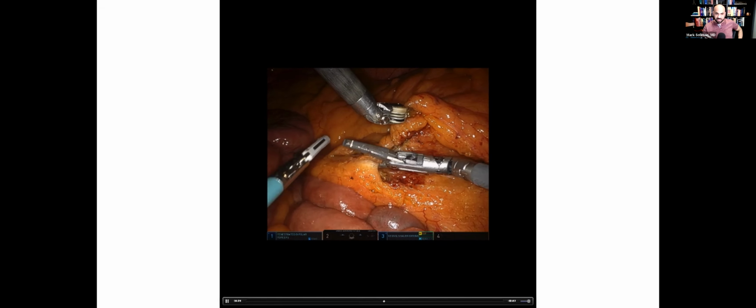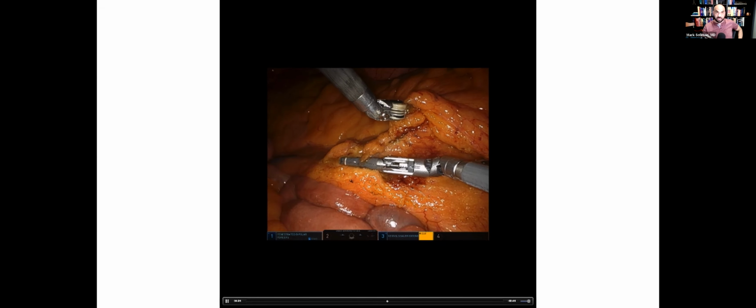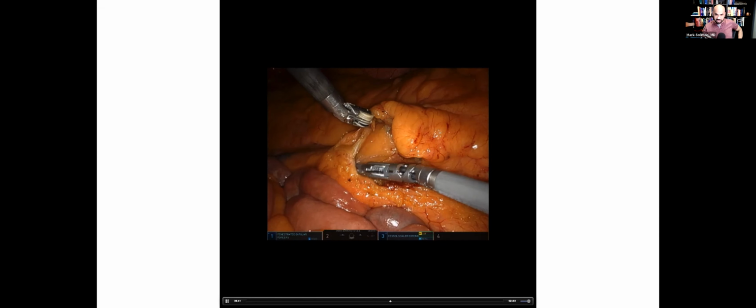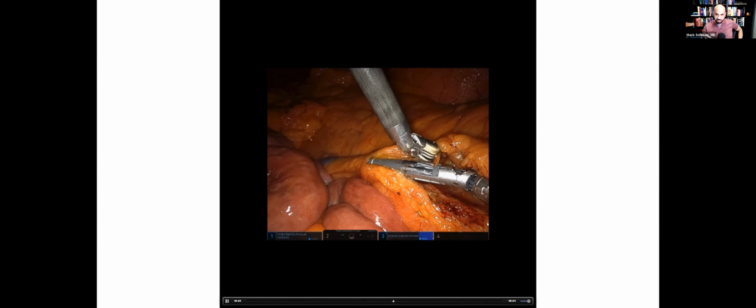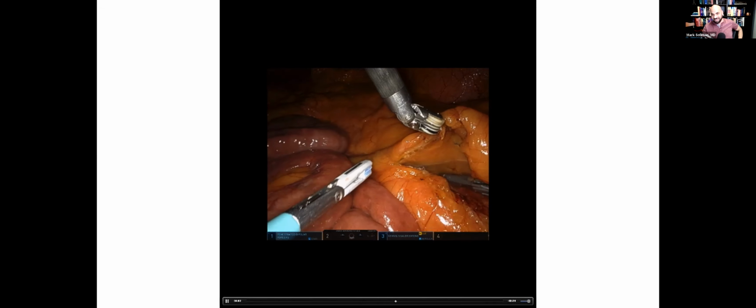And I think that there's not enough skeletonization of this vessel to safely do that maneuver there. So I'm glad this video was actually shown, because it shows you how not to do this. You can see IMV is a little bit higher up there, but please keep that between us. All right. So there's IMA ligation.